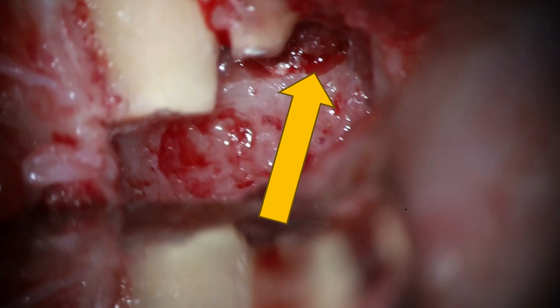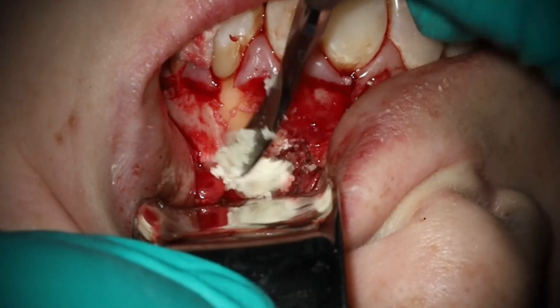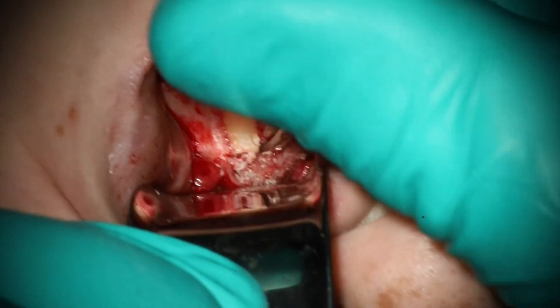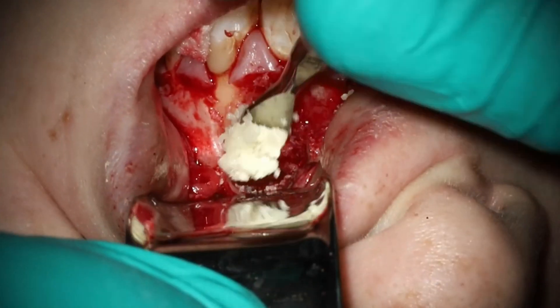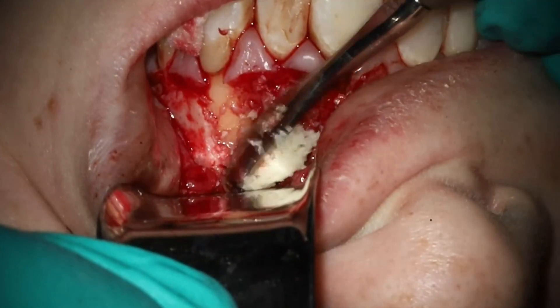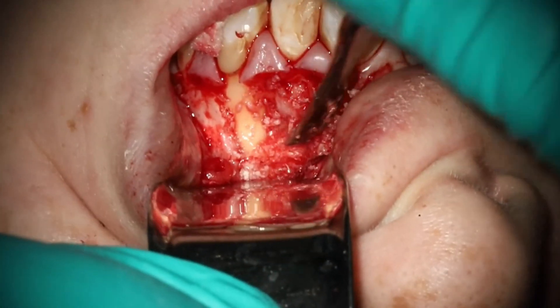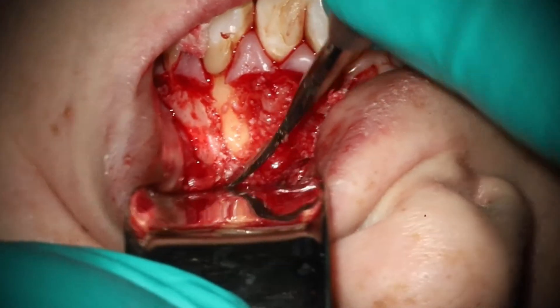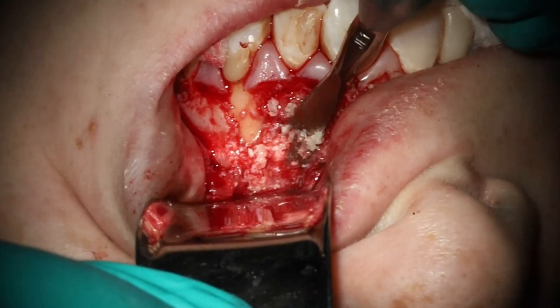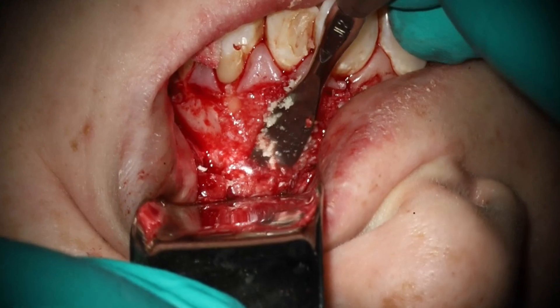Right there is why we have to graft — that is the palatal tissue. So what do we use for grafting? I'm going to use the stuff that the oral surgeon uses. This is a 50-50 corticocancellous mix. I don't stay up on all the grafting techniques because I don't do implants, but I trust that Chris does. One thing — this bone material does actually expire and it is incredibly expensive. If you're near an oral surgeon or periodontist who does implants, what I did with Chris is I bought a pack of five, and over the course of three years at this location, I'm finally getting through the fifth one. That way he uses it all up and none of it expires. A nice way to have it available without worrying about expiration if you're not doing a ton of grafting.